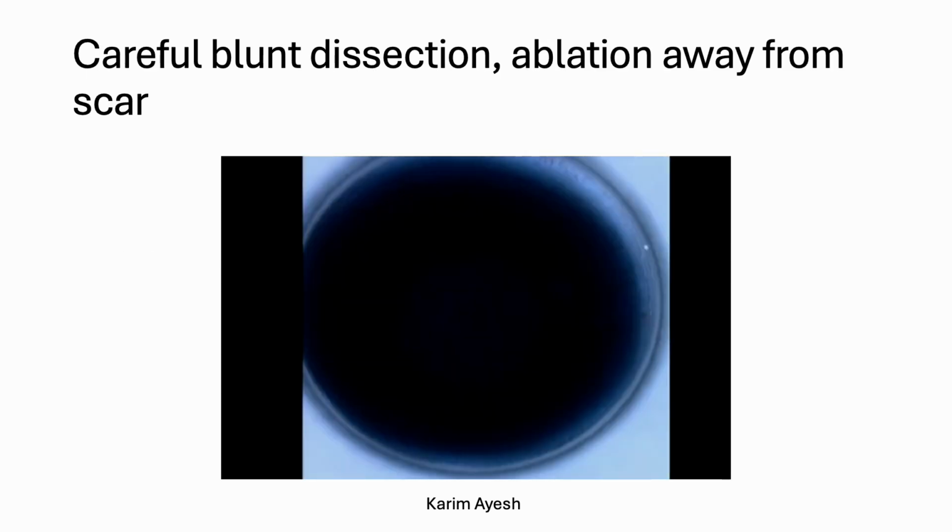I also calculated and saw that the meridian of the ablation is 145 and the scar is almost at 180. The scar is causing flattening, and in front of it steepening, almost reaching 49.5, but the ablation will be away from the scar. I will tell you later in the next slide about it, but let's see the operation here.